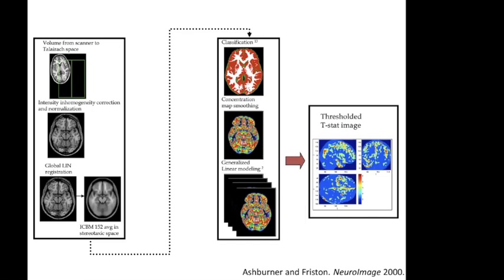Oh, the easiest thing you can actually do, and this is very common, especially in the animal imaging literature and the stuff that we do in my lab in animal imaging, is you just make a common space from the data that you have on hand. And so you don't have to worry about using a predefined common space. You create one that actually maps onto your population best.